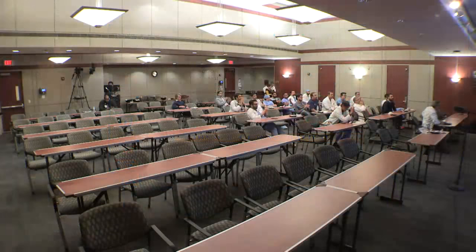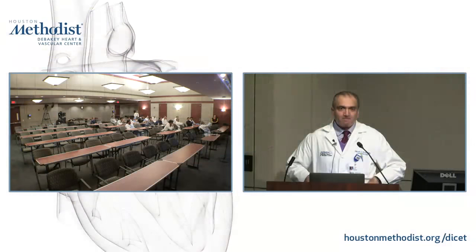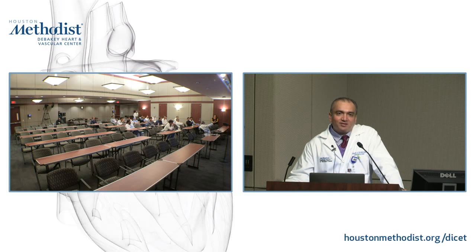Maybe just if there's a pressing question or two. Well, a comment and a question. The case you showed of sarcoid, the echo didn't move, but even at standstill, it looked like the asymmetric septal hypertrophy was there too. Yes, it's a beautiful example, because if you had stayed in the world of echo, this patient may have had an initial presentation of HCM and gone to the HCM mode of therapy. It was a very nice case because it presented with a picture by echo that could lead somebody towards HCM rather than towards sarcoid.